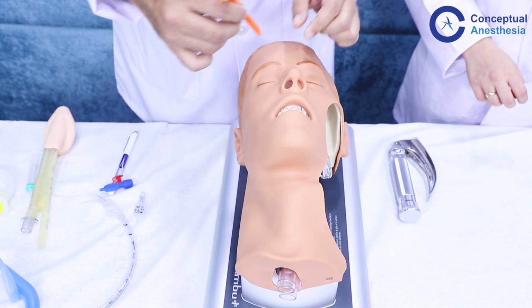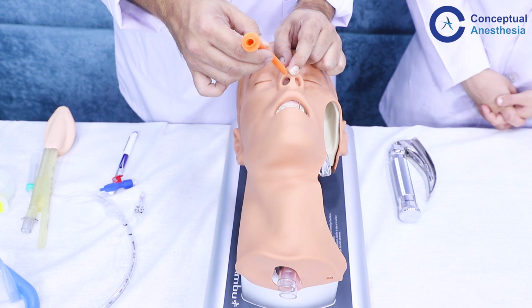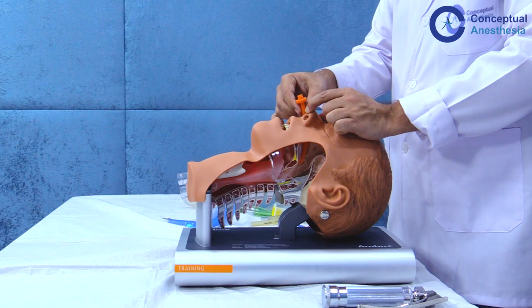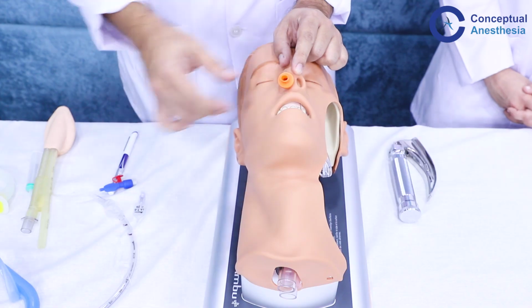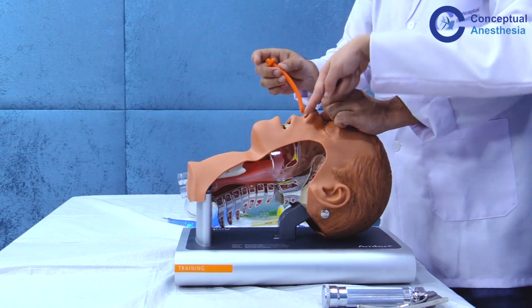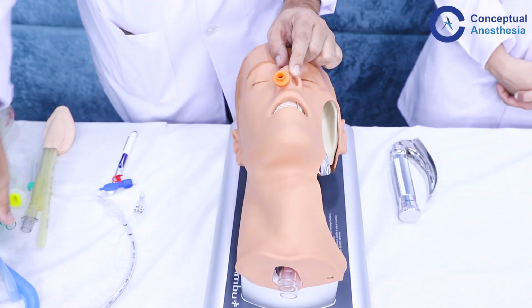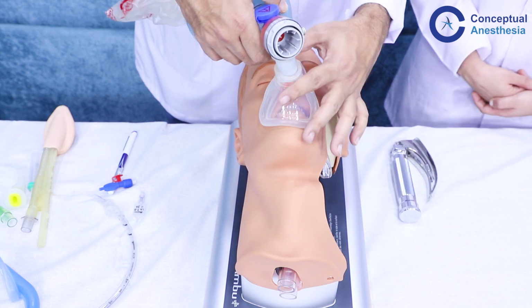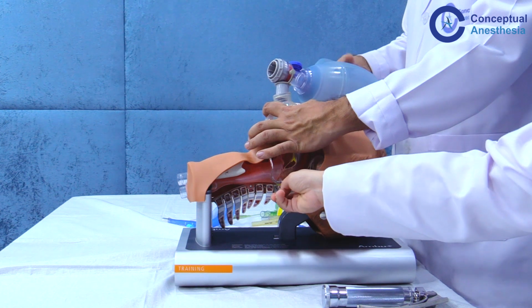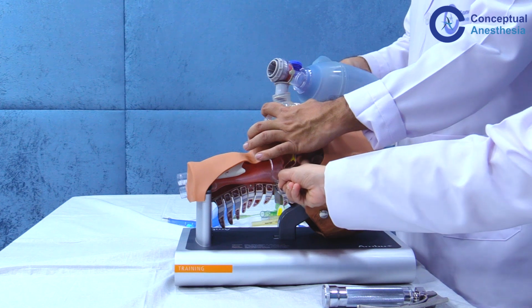Then we put water soluble jelly into the patient's nasal cavity and we introduce the nasopharyngeal airway with the bevel turned towards the nasal septum. Make sure that you don't force it. The direction in which you put the nasopharyngeal airway is straight down and then a slight curve, that is the direction of the floor of the nose. So you can see from the side that the nasopharyngeal airway has opened up the space between the nasopharynx and the posterior part of the nasal cavity.